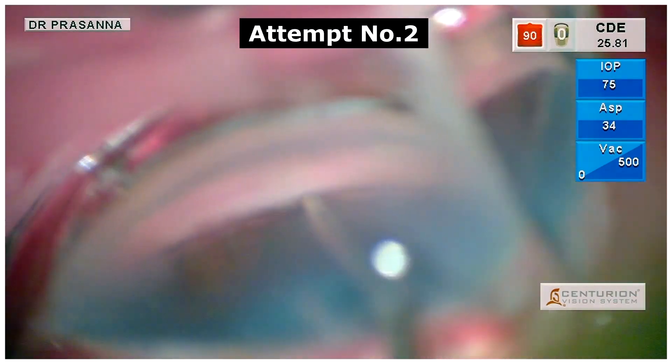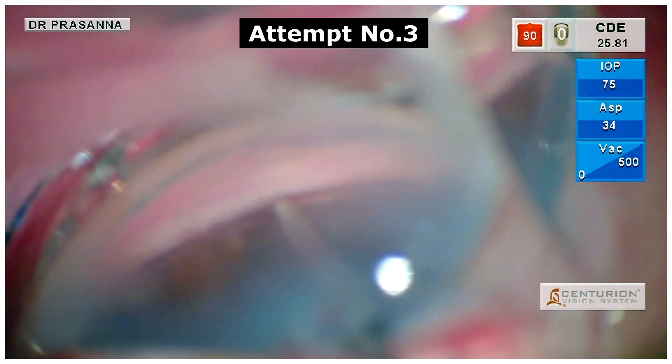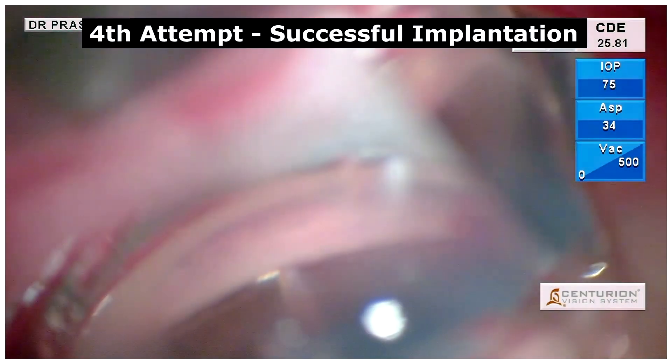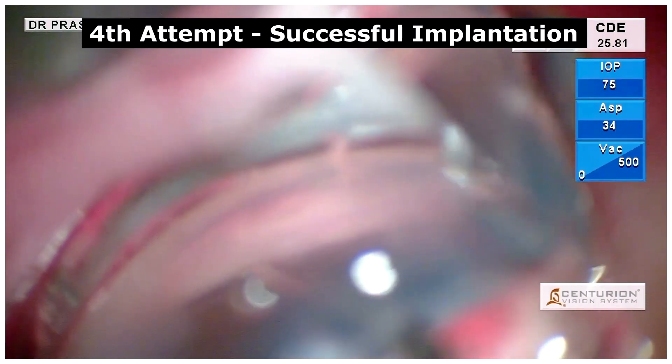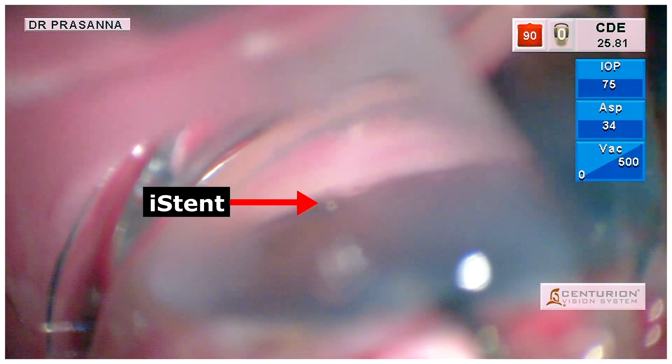With every reattempt, the trabecular meshwork gives away. So we had to change our maneuver into a more firm and forced glide into the trabecular meshwork for a proper implantation and a stable placement of the iStent.